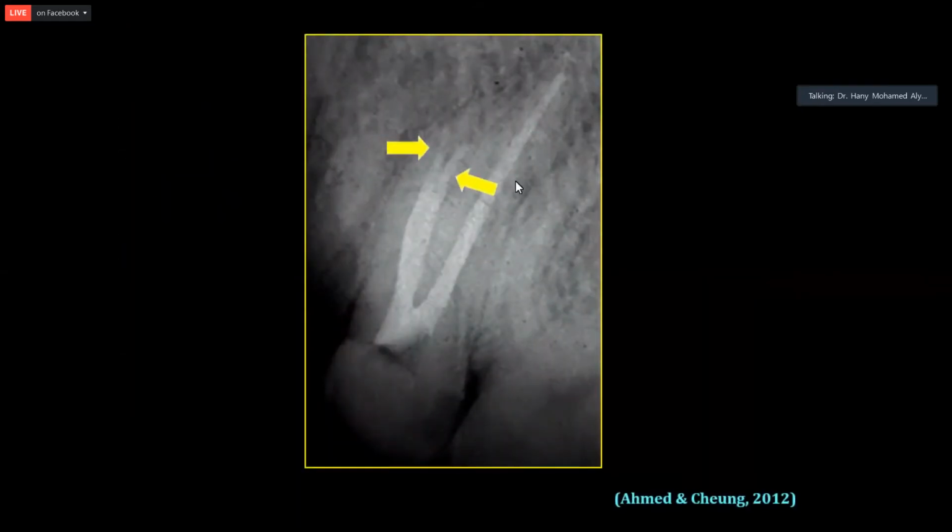And then after this, the obturation was done using a warm compaction, because usually such canals are very difficult to do lateral compaction. So I just obturated this canal using a warm compaction, so that the GP can go into the two canals. Những trường hợp như này thì sẽ rất khó để có thể làm lèn ngang như thông thường, cho nên trường hợp này bác sử dụng lèn nóng. Thì như thế gutta percha có thể chảy luôn vào hai ống tủy.